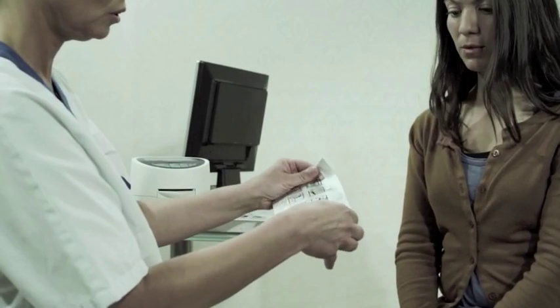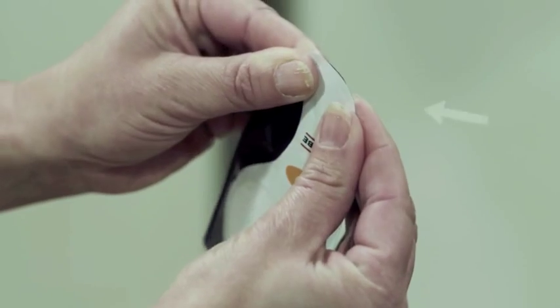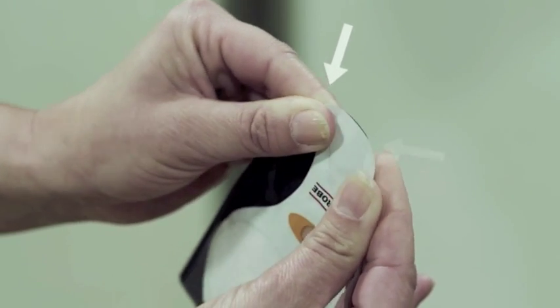Open the folio envelope and take out a breath card. Hold it between your thumb and index finger on each side of the opening and gently press the sides together to open the mouthpiece.